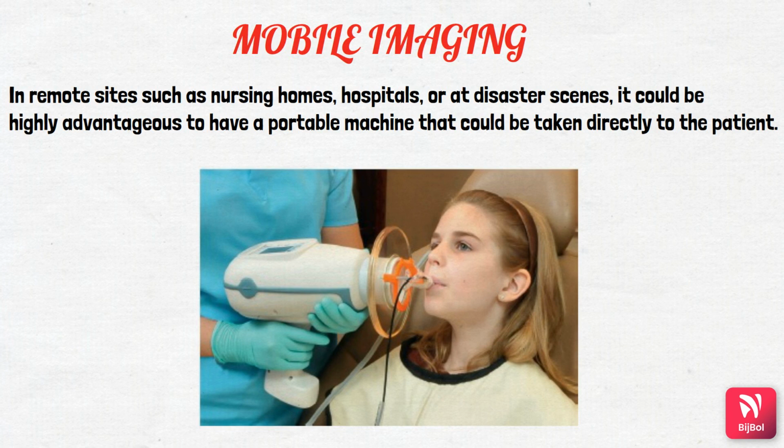The machine uses about 60 kilovolt constant potential and has a short focal spot to skin distance of about 20 centimeter. Both these factors allow for a short exposure time compared with the conventional units. It has a small focal spot of about 0.4 millimeters. The operator dose is mitigated by the use of internal shielding materials in the unit to reduce the exposure leakage.